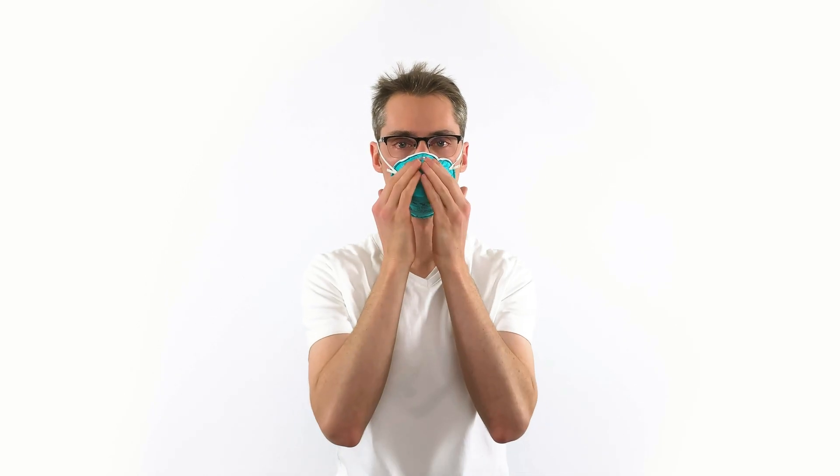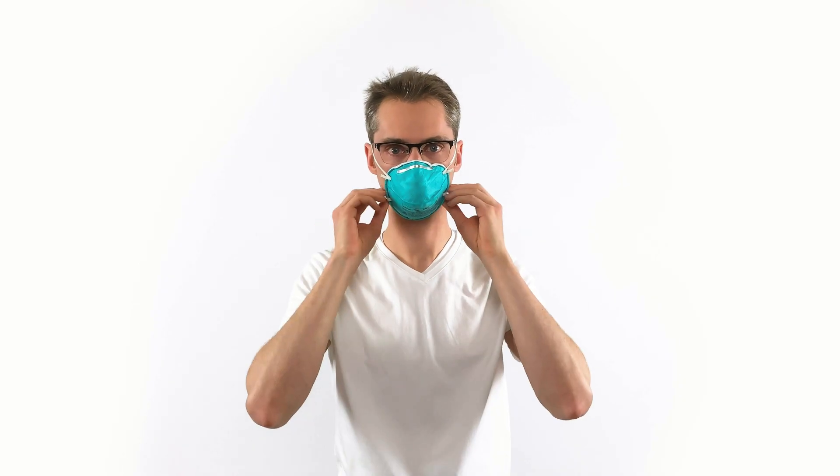No air should leak through the mask's edges. If air leaks around the nose, adjust the nose piece. Around the other edges, adjust those straps. You should have a good seal. If you can't quite get a seal, abandon this mask and try your luck with a different N95 make or model.